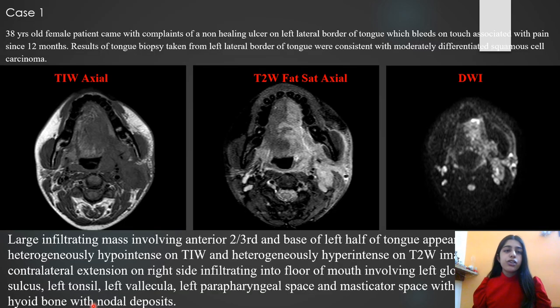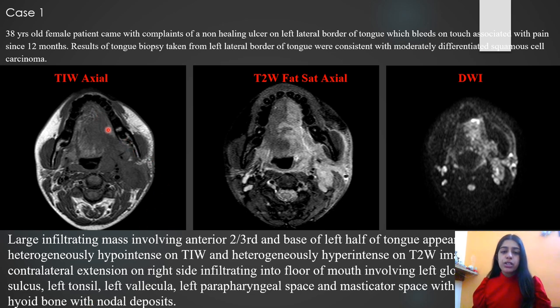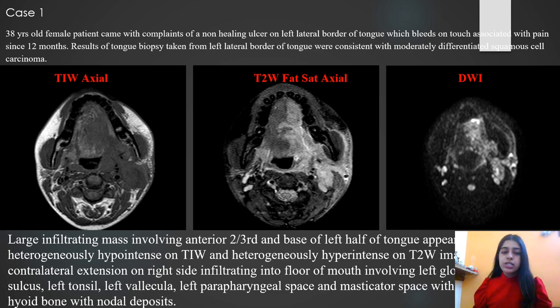The first case is of a female who presented with a non-healing ulcer on the left lateral border of the tongue, which bled on touch. Histopathological studies revealed a moderately differentiated squamous cell carcinoma. The MRI images show a large infiltrating mass involving the anterior two-thirds and base of the tongue, appearing heterogeneously hypointense on T1-weighted images and heterogeneously hyperintense on T2-weighted images, with contralateral extension to the right side infiltrating into the floor of mouth, glossopharyngeal sulcus, left tonsil, vallecula, left parapharyngeal space, and masticator space, with hyoid bone erosions and nodal deposits.